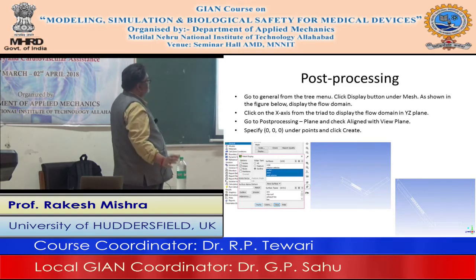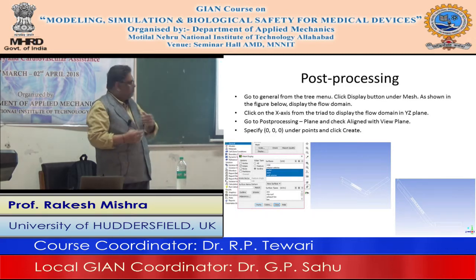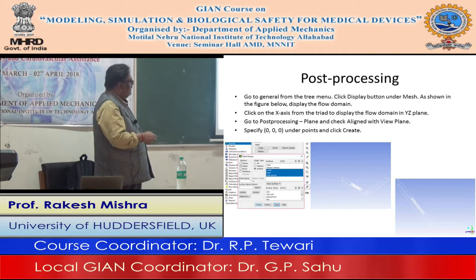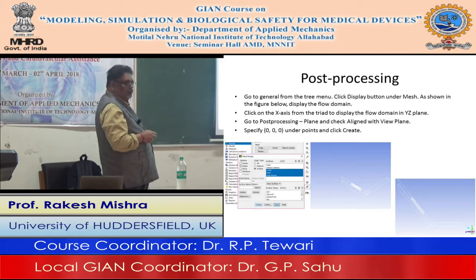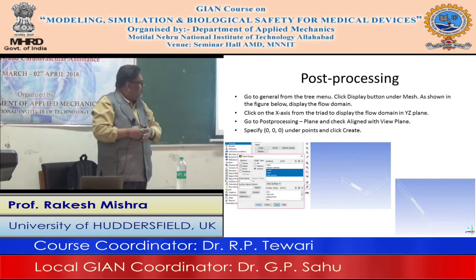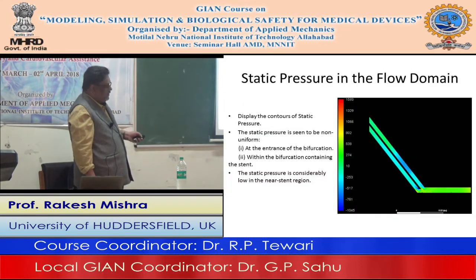You can create some planes on which you want to analyze the flow. The stent is already selected, so you can have a look at what is happening on the stent. But we may need to create some planes. So for example, if you go to post processing and go to plane, and check aligned with the view plane, we can create new planes on which we can see the flow, because in a three-dimensional system you would like the flow to be seen on a plane. Okay, so you can create planes, and this one goes through the center of the bifurcation, and you can see the flow features on this particular plane.